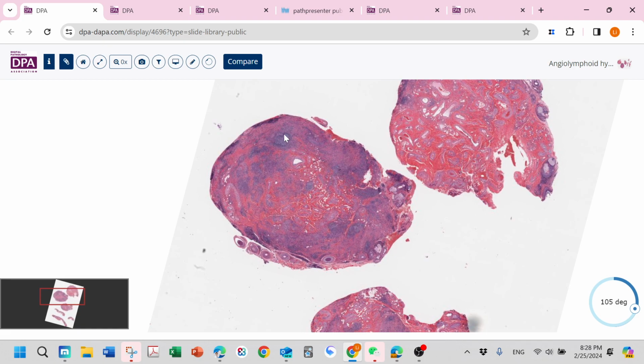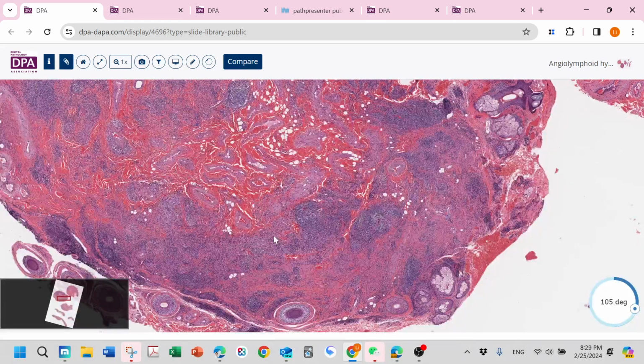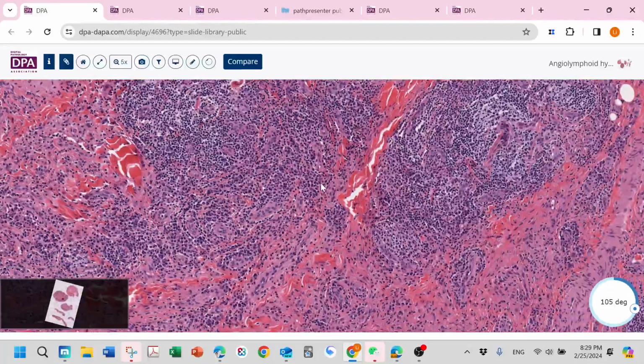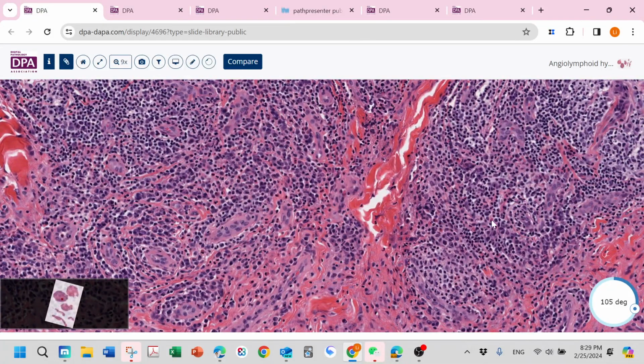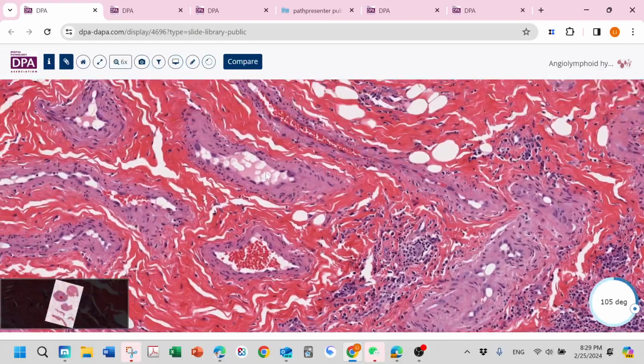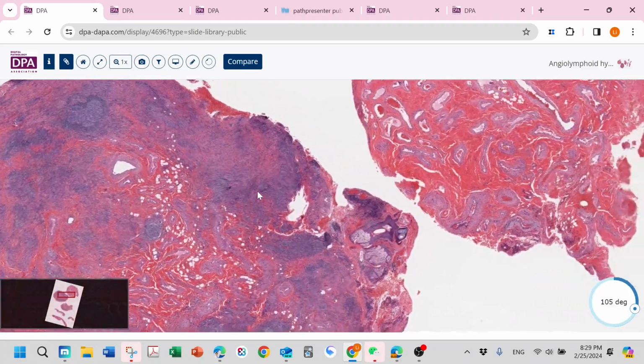If you see a true germinal center, there's another disease called Kimura disease. The microscopic features are identical to ALHE. But when you zoom in, other than this lymphocyte proliferation, you will usually see tons of eosinophils inside. So you may just think, could it be ALHE? And then you need to find other features.